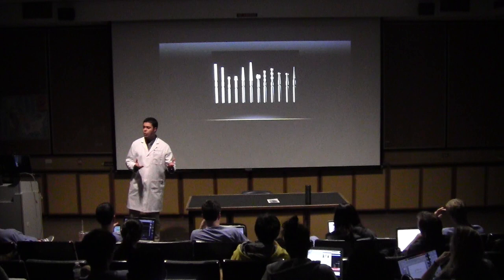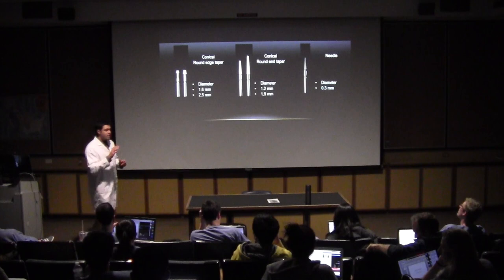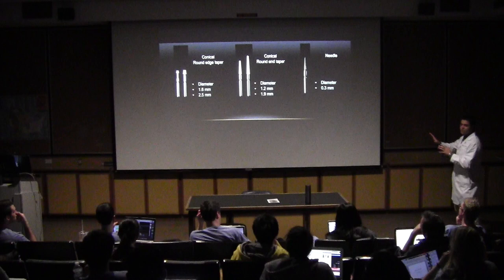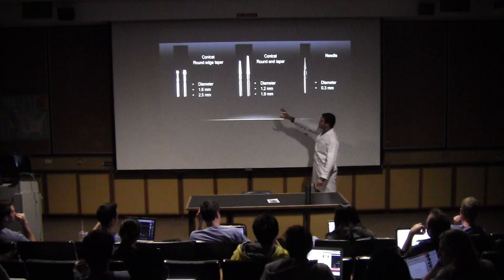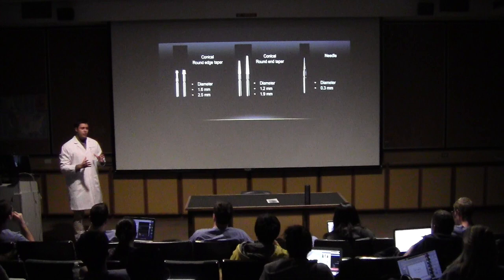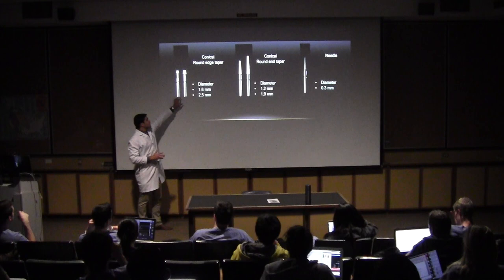Okay? So for now, keep in mind just these 5 diamond points. There are much more, but for now, let's just think about these 5. We have here the conical round edge taper with 2 different diameters, 1.6 and 2.5. Depending on the size of your prep, you can choose one or another, right? The diameter is in the active point, in the active tip, all right?